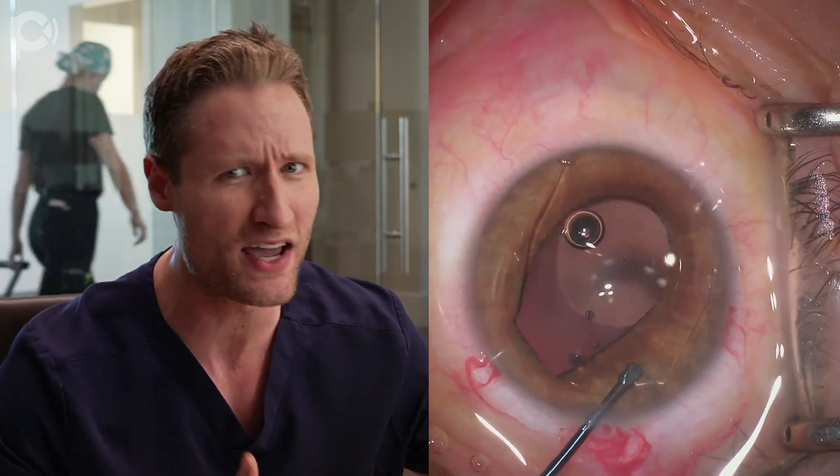If you wait to put viscoelastic in until after the lens is in, you don't have to remove any from behind the lens. The viscoelastic I use is a cohesive — ProVisc — rather than OccuCoat. OccuCoat is vaguely dispersive so you don't know if you're getting it all, whereas I'm positive that with an IA handpiece I can remove all of the cohesive viscoelastic from on top of an ICL.